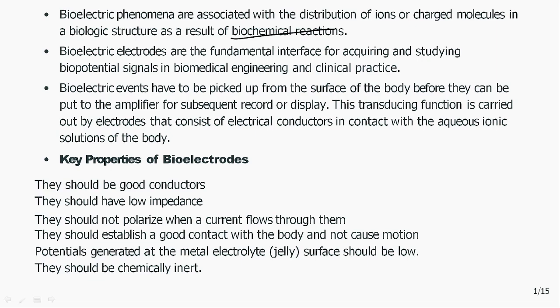So this creates action potential, and these bioelectric electrodes are the fundamental interface for acquiring and studying biopotential signals. These biochemical reactions produce different ionic exchanges, and those ionic exchanges must be converted to an equivalent electronic conduction, and this process is known as transduction. Through the transduction function carried out by the electrodes, we can capture those biopotentials.